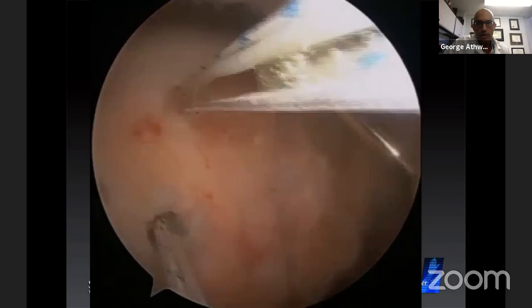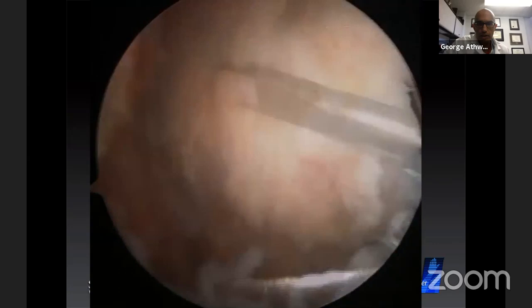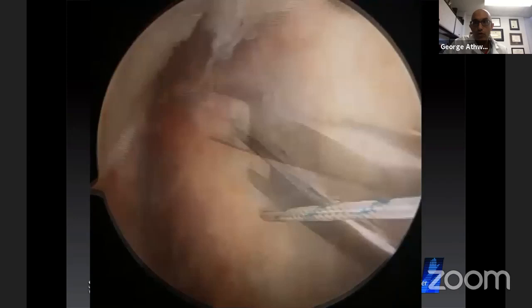And then I'm going to come in with my antegrade suture passer. So I'm passing from lateral to medial, and my assistant is going to go ahead and pick up these sutures. So these are going to be the medial row sutures for my subscap. And once again, I start from inferior and work my way up superior.